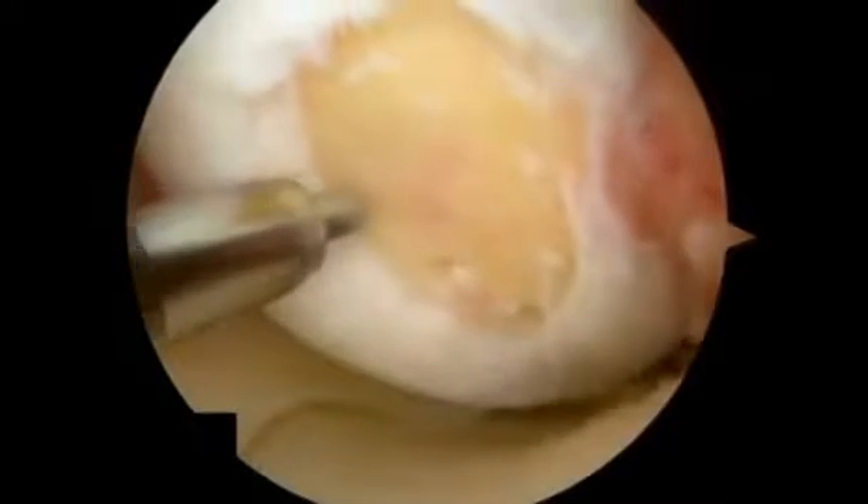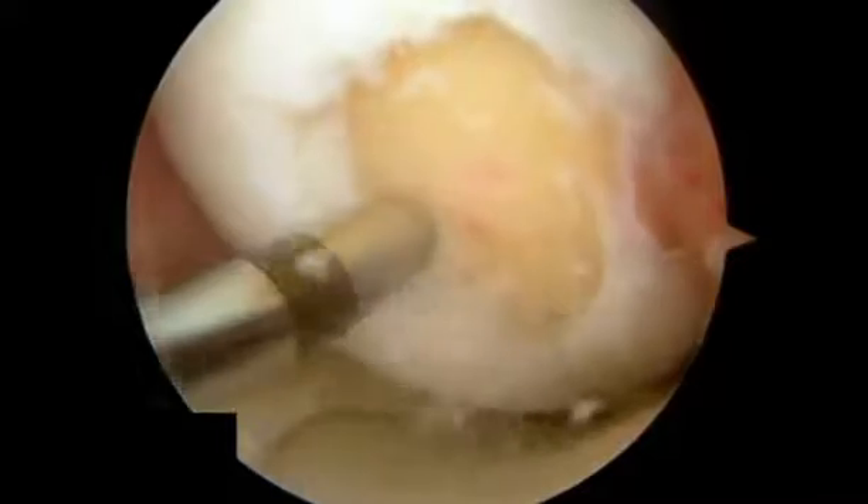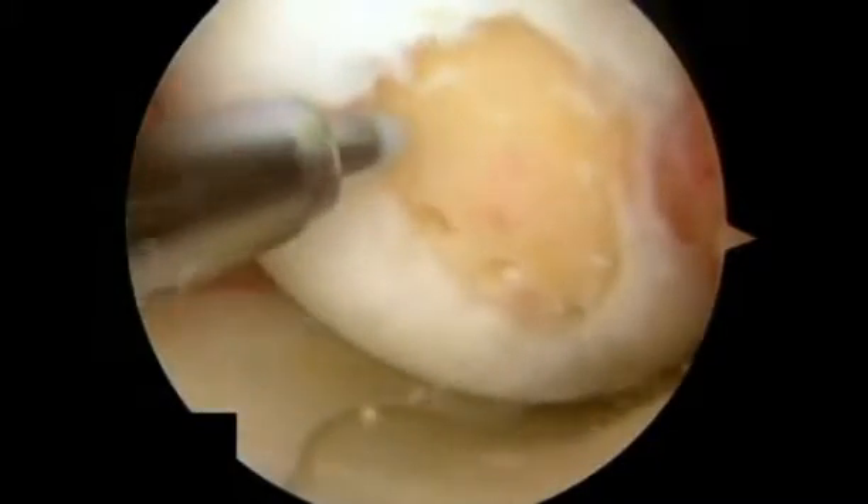The preparation is done with either rotary resection devices or with manual instruments such as curettes. Any loose or marginally attached cartilage at the periphery of the defect is also removed until a stable rim of cartilage remains.